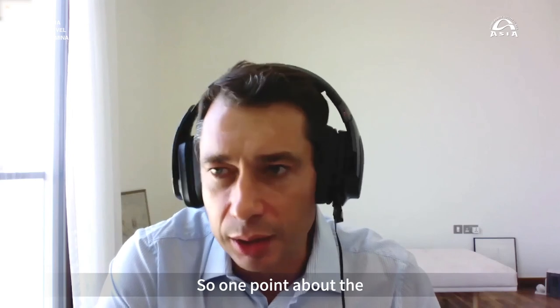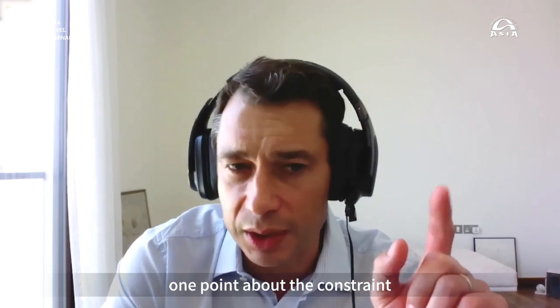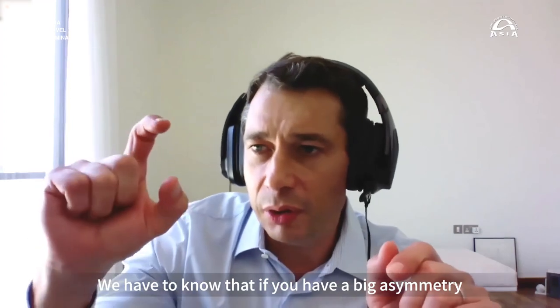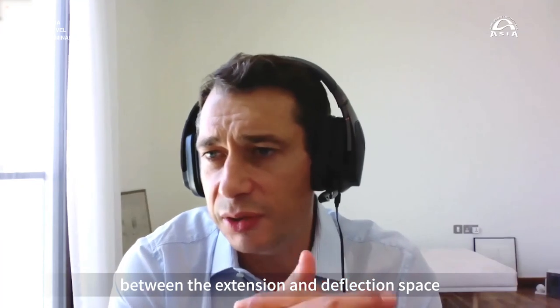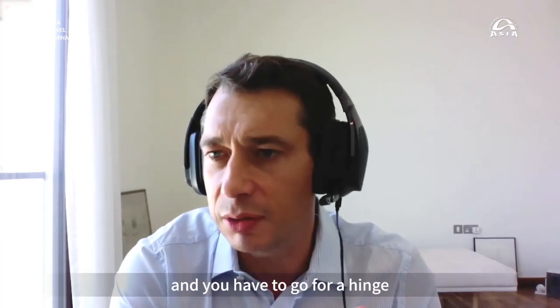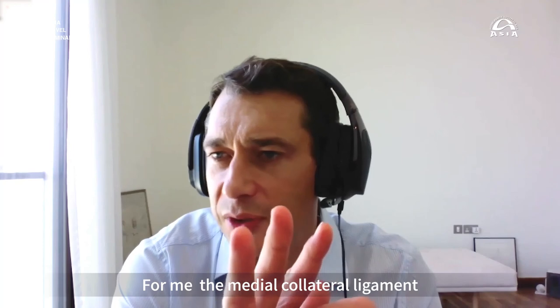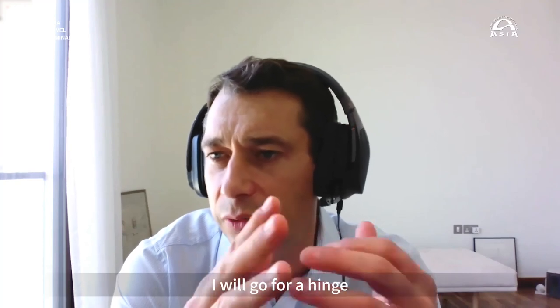So that's for the approach. One point about the constraint. You have to know that if you have a big asymmetry between the extension and the flexion space, a CCK type of implant is not enough, and you have to go for a hinge. And I'm even stricter than you. For me, if the medial collateral ligament is not functional anymore, I will go for a hinge.